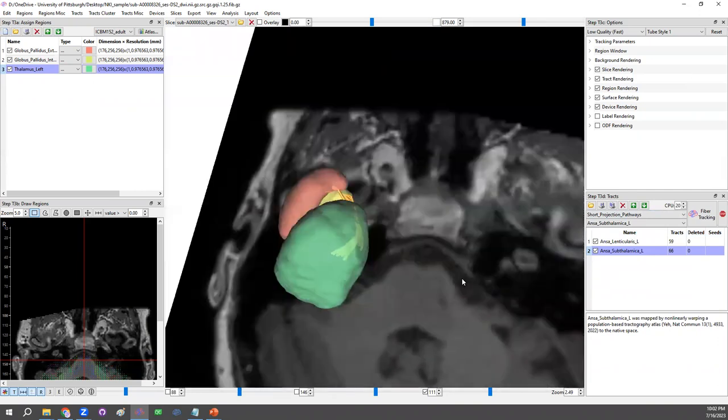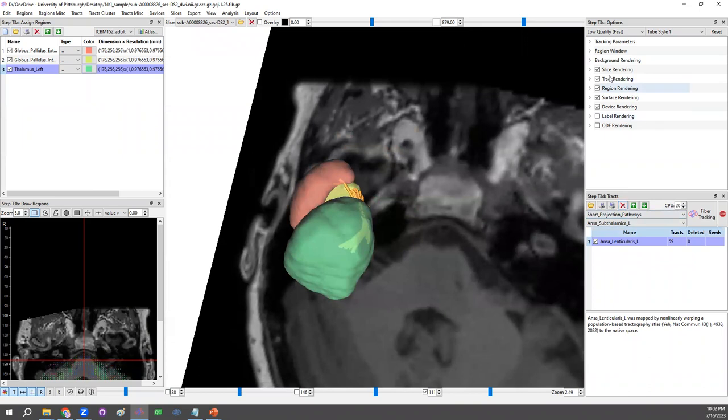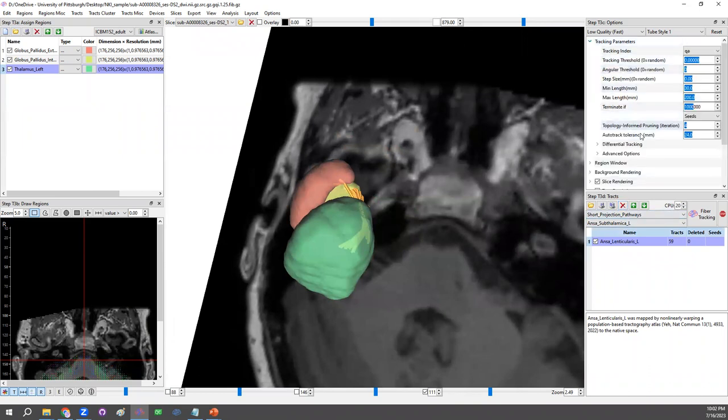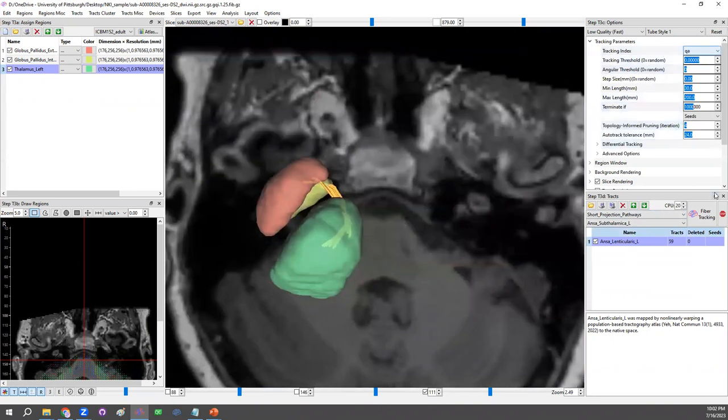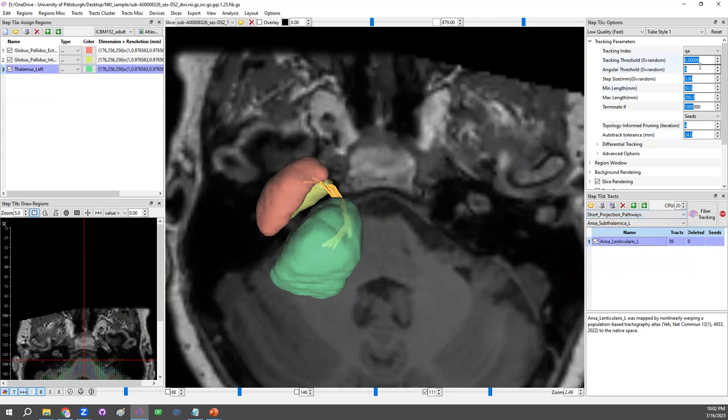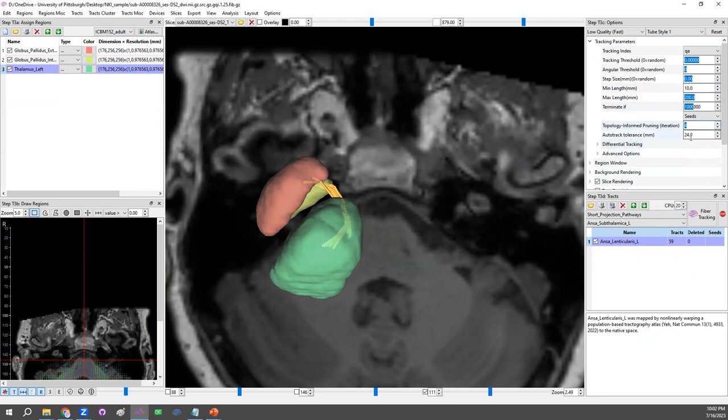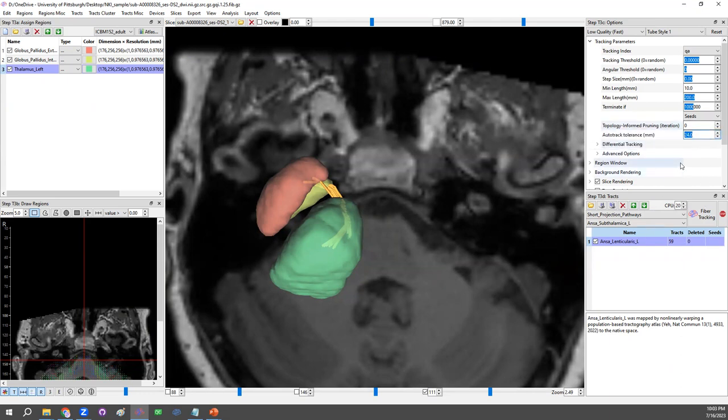A lot of time, since this is a short pathway, the group average mapping from the atlas would be maybe sufficient enough for most of the application. Other examples like the ansa subthalmica. We could also bring in using those built-in atlas. Of course, we could also run individual mapping on this short pathway. And that's in here, we would need to change the tracking parameter. Because those default parameters are primarily designed for association pathway, which is much easier to map and much larger. For mapping the short projection pathway or some difficult pathway, you may need to change some of the settings here. For example, for this short pathway, we may need to reduce the length, which is 10mm. And also, we may need to remove the pruning.